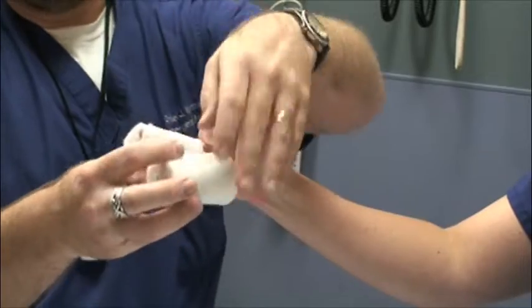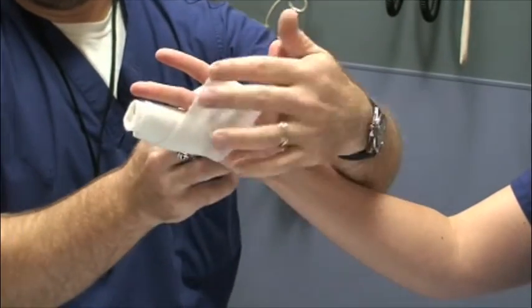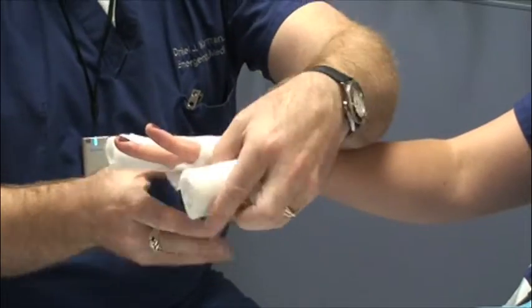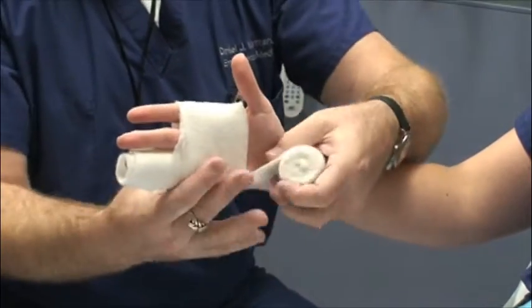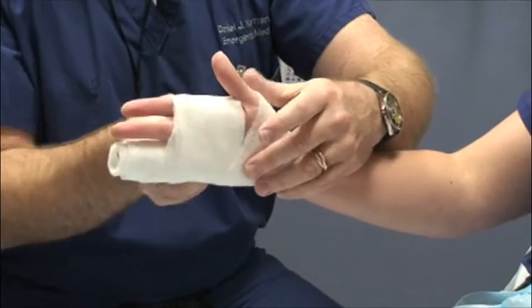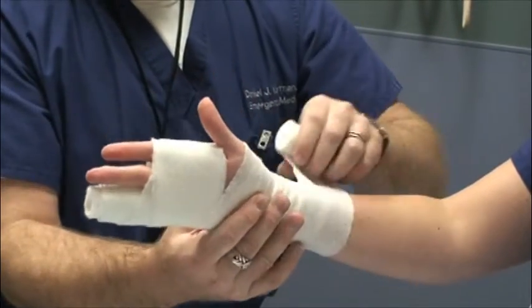At the end we want to have 3 or 4 layers because that's where the pressure point is at the end of the splint. Over the bony prominence where the injury is, those are other areas where you want 3 to 4 layers of wrapping. Other than that you really only want about 2 layers. Too much wrapping can cause a problem — that big bulk of material would actually create a pressure point. So you want 3 to 4 layers over bony prominences and roughly 2 layers over the rest of the extremity.